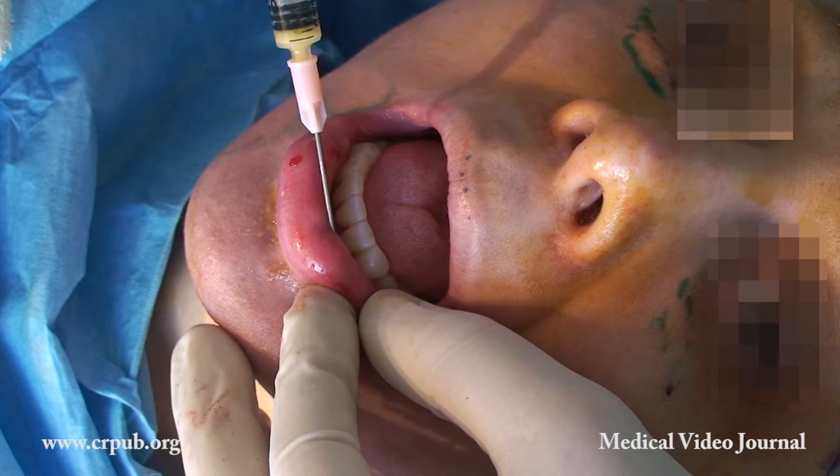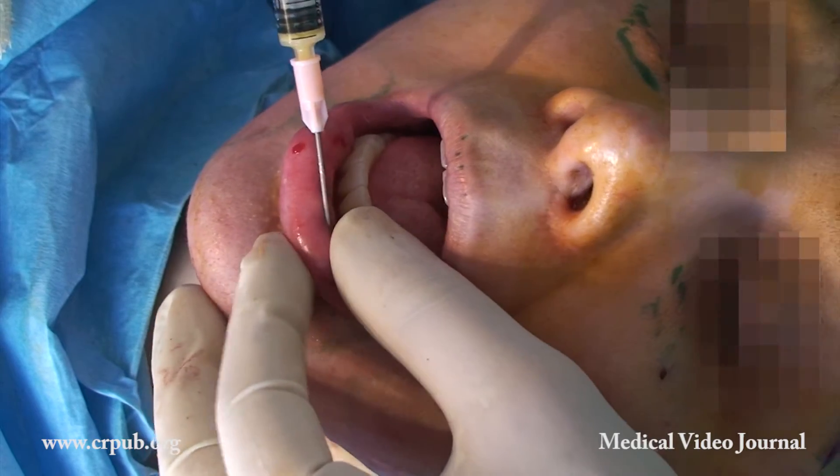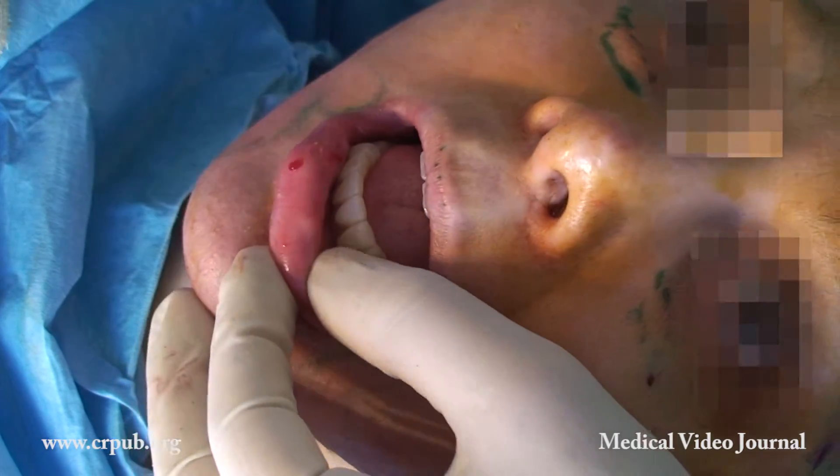On account of its versatility, absence of complications, and excellent results, adipofilling constitutes the gold standard for fat transfer.